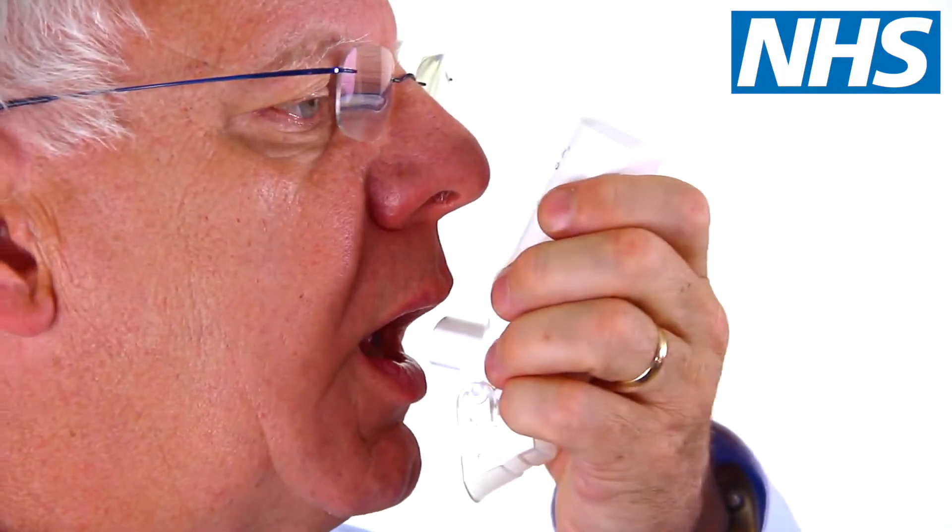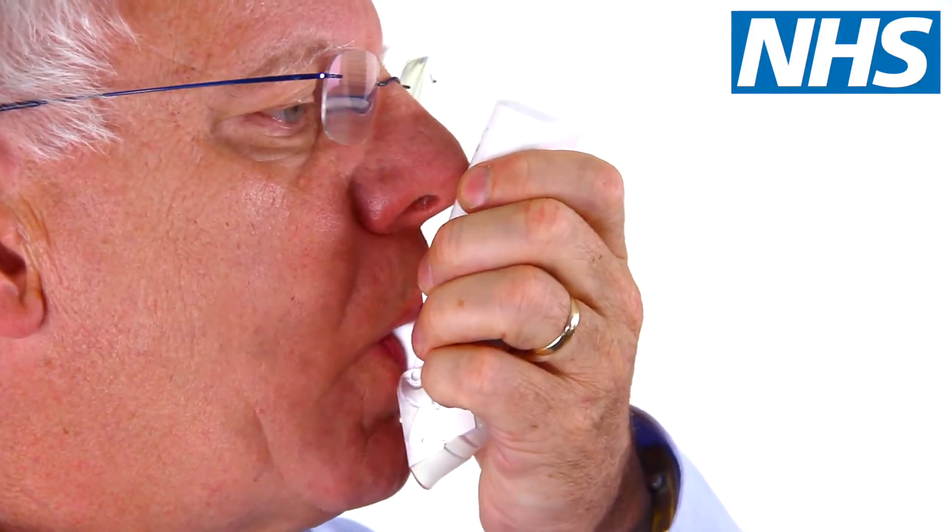When you're ready, breathe out gently as far as you comfortably can, but not into the mouthpiece. Place the mouthpiece into your mouth and between your teeth, but don't bite down on it. Close your lips around the mouthpiece to form a tight seal.